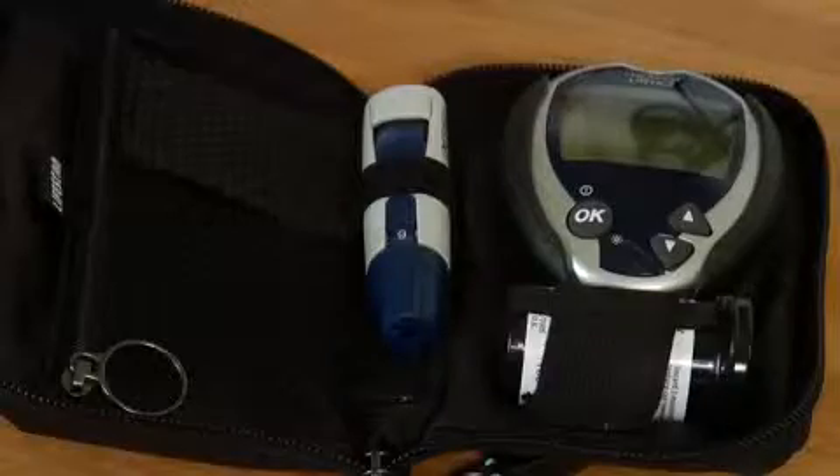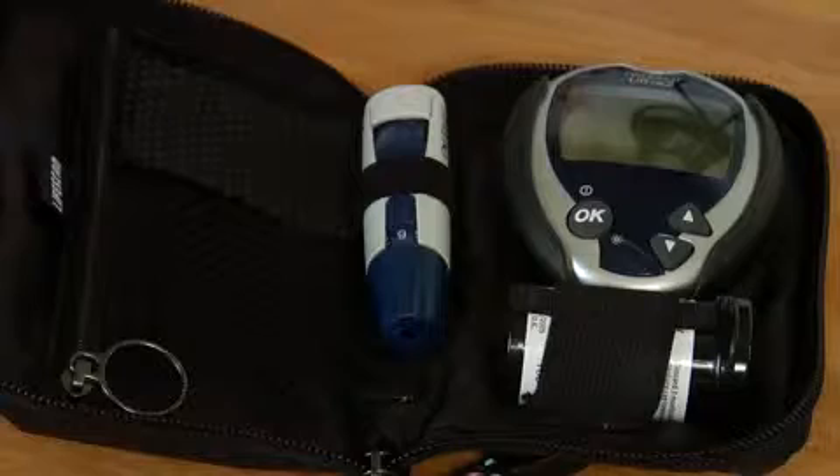Hi, my name is Katie Brosnan, I'm a registered nurse here in Austin, Texas, and today I'm going to tell you how to use a glucometer. We're going to talk about the most commonly used glucometers that are at home — there are a couple of components that they all have, and I'm just going to kind of walk through those.